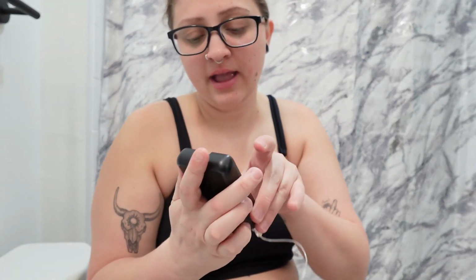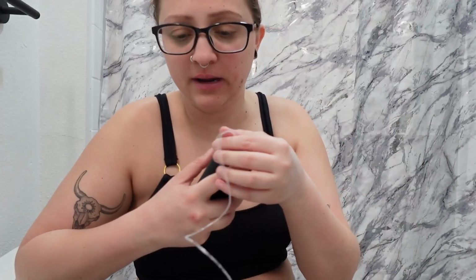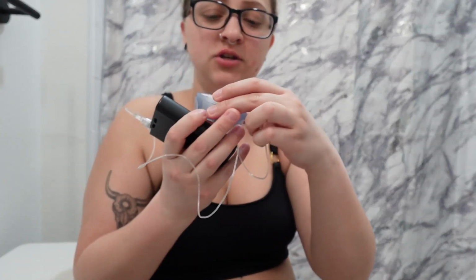Then I'm gonna go ahead and just unlock, and we're gonna go ahead and go to fill tubing, and I'm gonna fill the tubing, and I'm gonna have the cartridge upright so that all the air bubbles go out. And of course it locked quickly. All right, we're gonna go ahead and press and hold until I see bubbles.